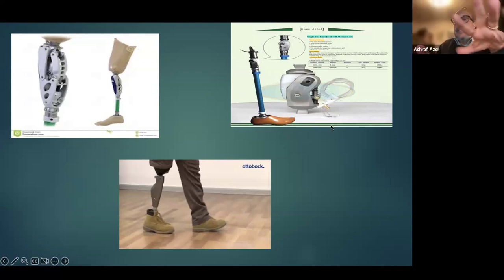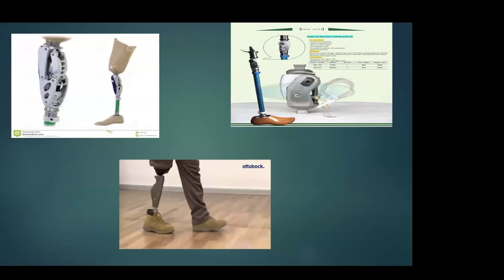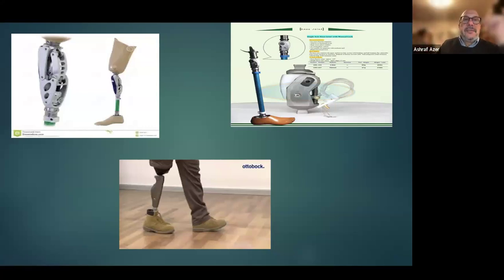If simply as that, you see a cable attached to the socket, it means it's a fixed knee. Simple as that. There is no cable, so it's a free knee. What type of free knee is not your problem, to be honest. It would be very cruel from the examiner to ask you what type of free knee. We don't ask this question for the rehabilitation registrar. So complicated, okay? So either fixed or free, okay?